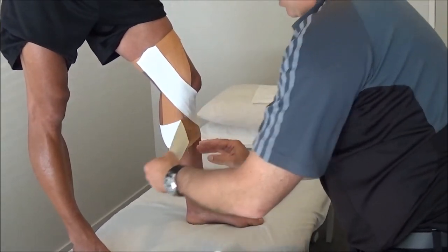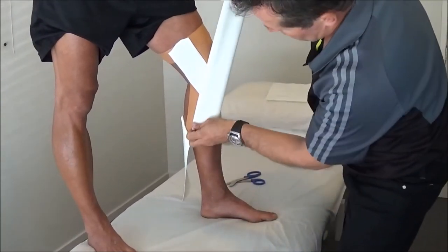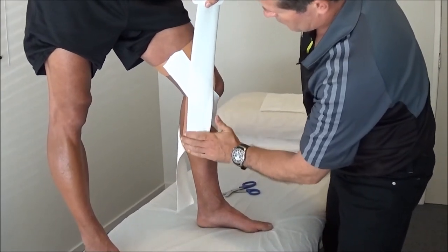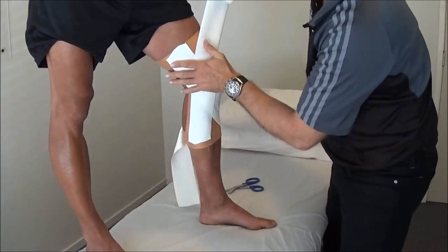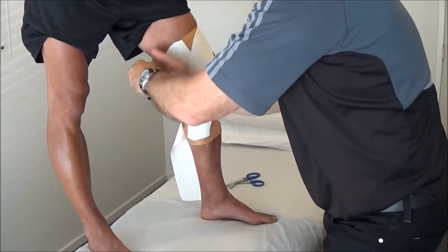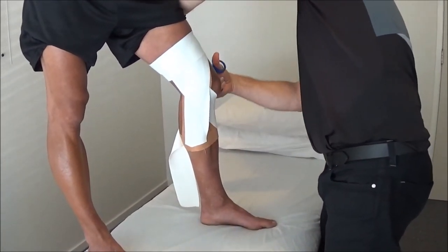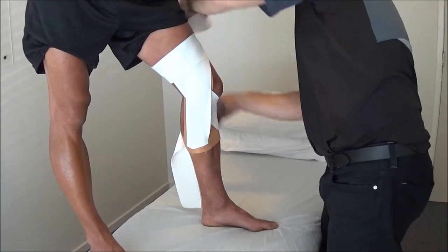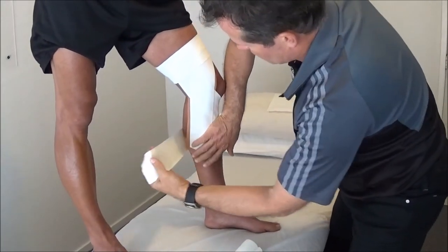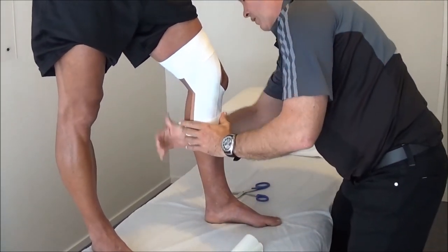Undo that again, just let it drop down here, and using our roll again, this time starting down low, we're going to come up and wind around the top, come over the first part, and we'll cut it off like that, and pick up the original bit that we had and bring that around like so, and fix that off.